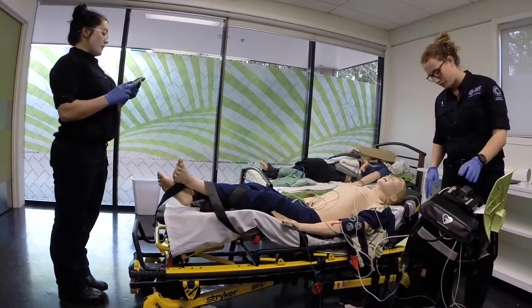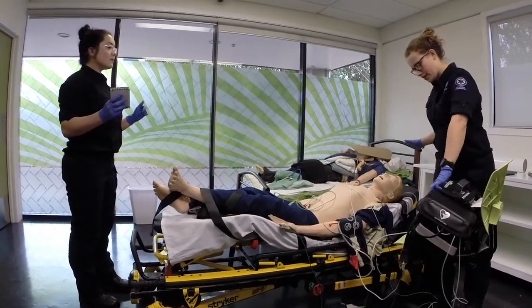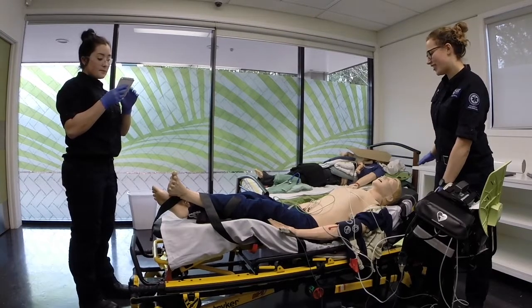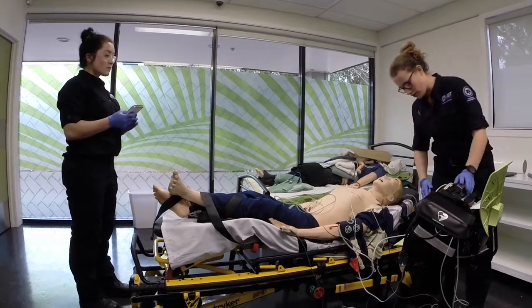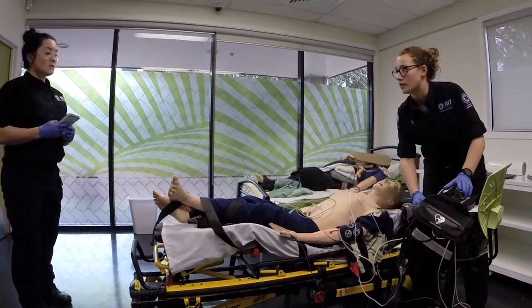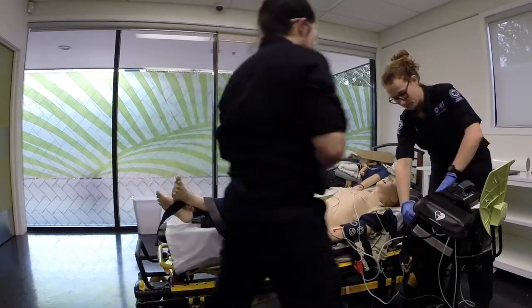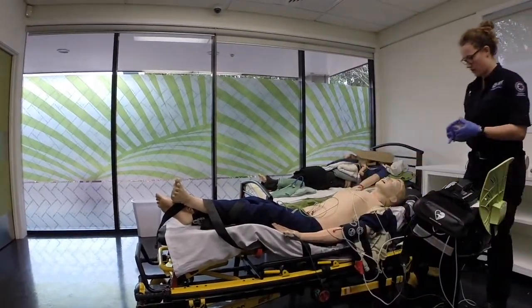Select the joules, charge the defibrillator and confirm everybody is clear. Cool, so we're going to maximum joules, all clear, just charging. And now all clear, shocking, cool. Now just assessing whether or not it's gone into normal rhythm, I'll give him a print. If you can please get another full set of obs, and then we'll see where to go from there. Once you've done that, if you can get a running line going. Yeah. Just push that BP. Great.